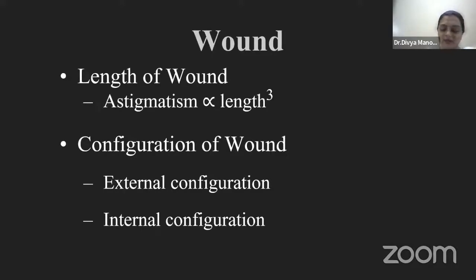Astigmatism is directly related to the cube of the length, and it is inversely related to the distance from the limbus. That's why the more posterior your incision, the better it is. However, too posterior will cause difficulty in handling your instruments.